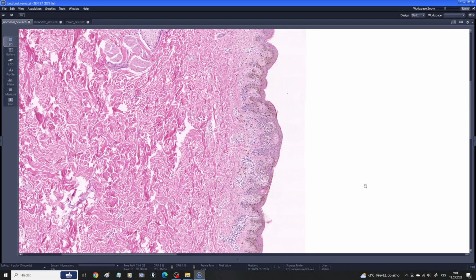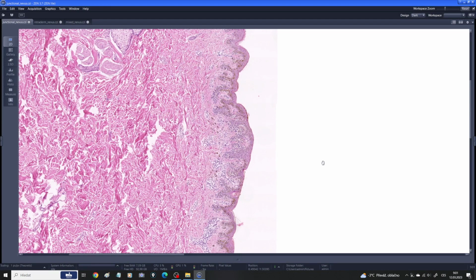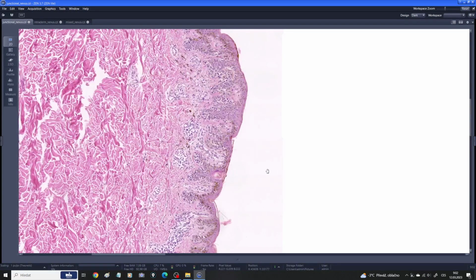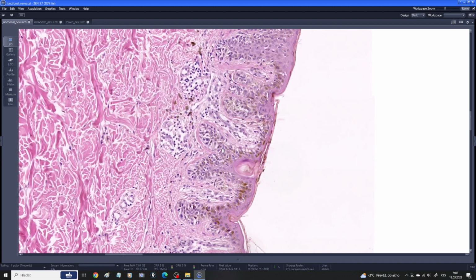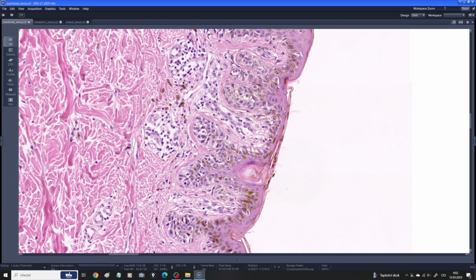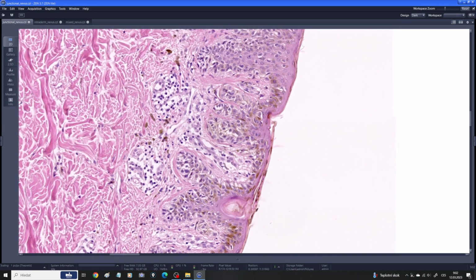Okay, so now let's move to nevi. So melanocytic nevi or pigmented nevi are considered to be true neoplasias in contrast to lentigo simplex. So these are benign neoplasias. They are very common. And as I mentioned before, in the case of nevi, you can see a proliferation of melanocytes that form 3D structures. So they grow in clusters and balls and nests. So it is not just a single line of melanocytes as we could see in lentigo simplex, but this is a 3D structure.